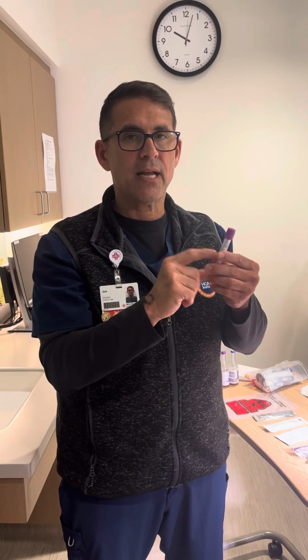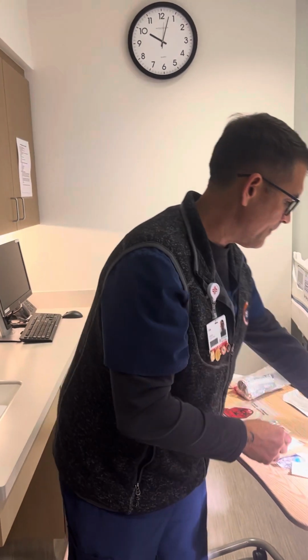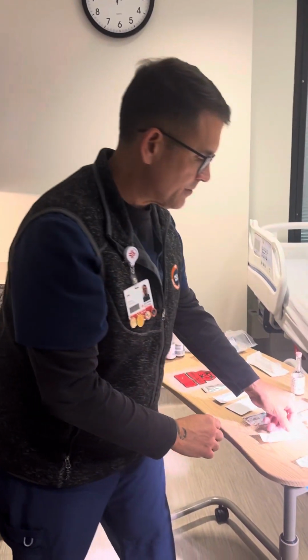So this one cannot clot. If you ever are drawing blood, and when you go to put it in here, it's just little clots of blood, just throw it out, draw it again. This one has to be free flowing for it to be good. All right, different things that we're gonna use.